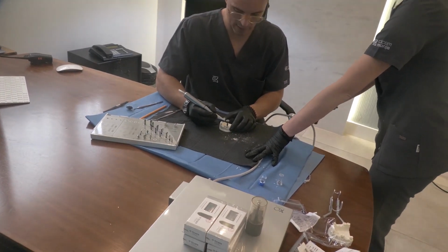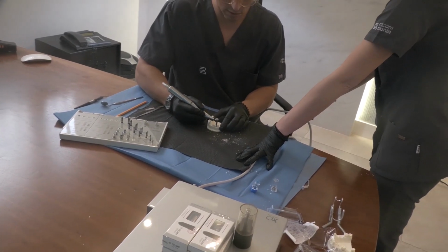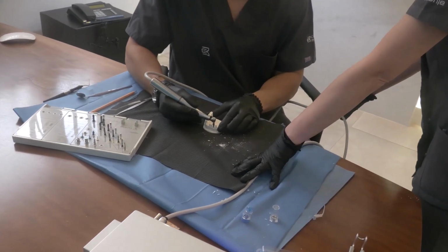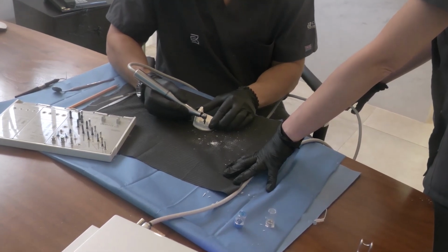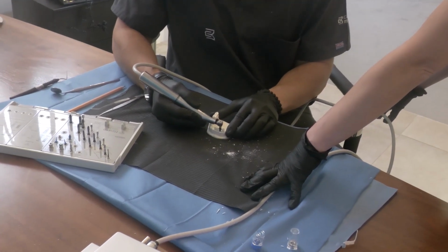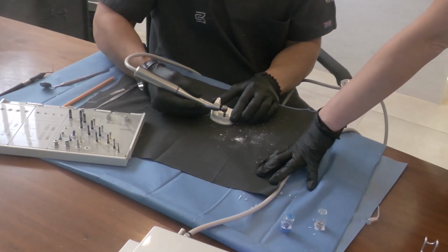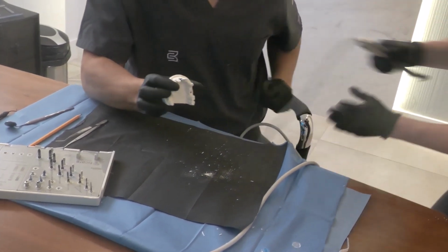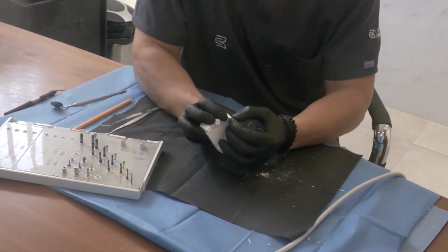So it's placed right at the ideal position. You can see how I have moved the dental implant slightly more towards the palatal in order to promote the emergence profile coming out from the cingulum position, which will provide a benefit in terms of aesthetics.